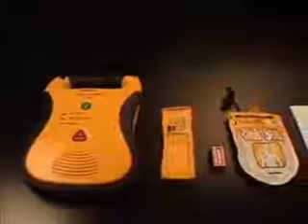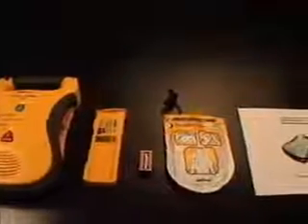The critical components of the Lifeline AED system are the Lifeline AED, a lithium battery pack, a 9-volt battery, a pad package, a user's manual, and optionally a data card.